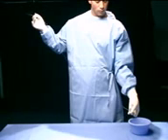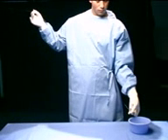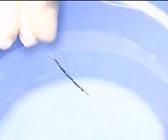Grasp the very distal end of the clear section of the delivery sheath and submerge the filter in heparinized saline. While immersed, pull back on the wire and gently draw the nose cone into the delivery sheath until resistance is felt. The nose cone is designed to enter the distal tip of the delivery sheath 1 to 2 millimeters. The device is now ready for the intervention.